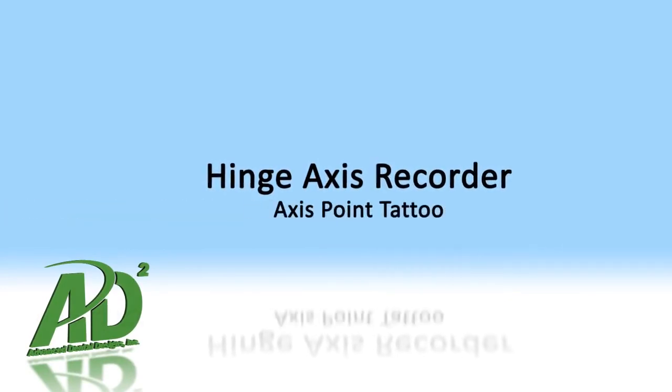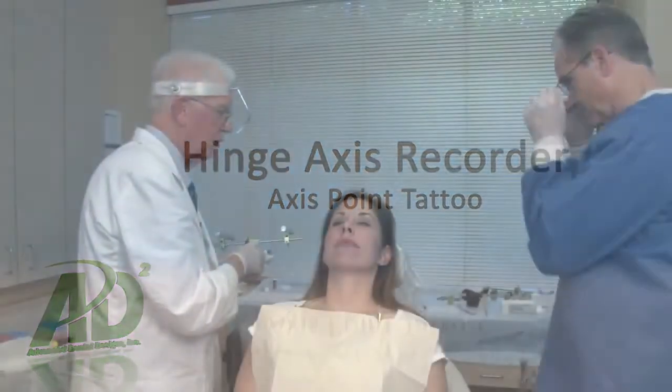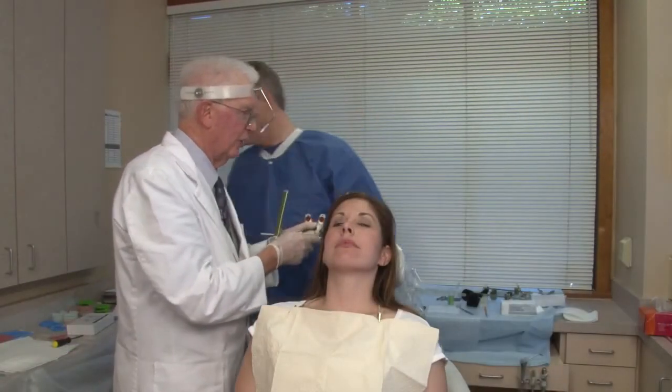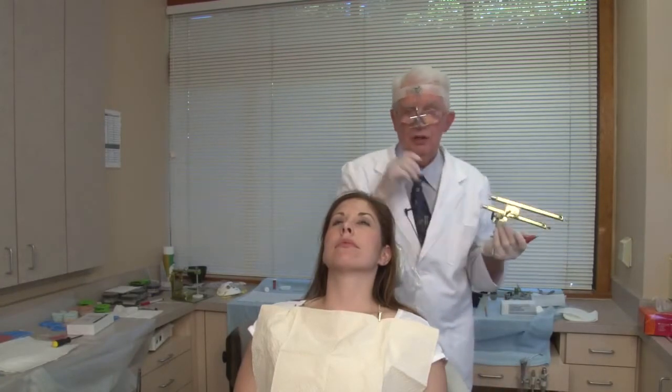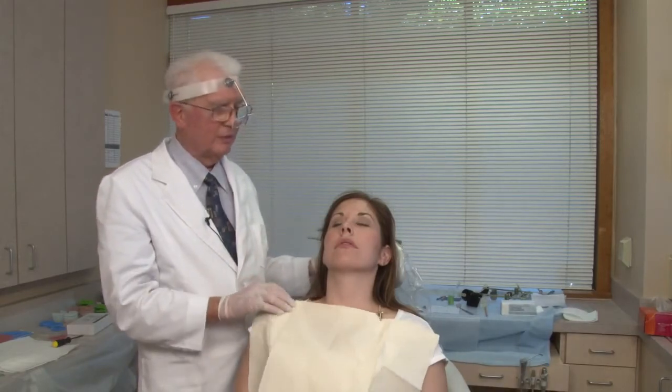There's one other procedure that we have to do on the patient, and that is what we call a tattoo. We're going to use a needle and some tattoo dye and actually deposit a little tattoo dye just under the surface of the skin. That way, 6 months from now, a year from now, we can still locate that hinge axis dot on the patient's face, and we don't have to go through all this procedure again.